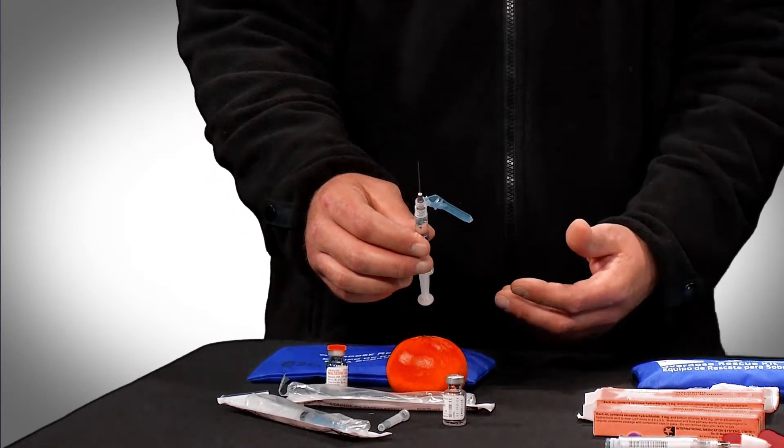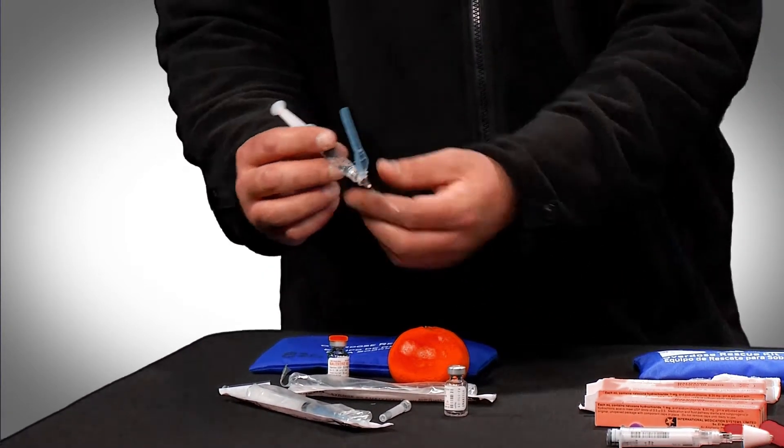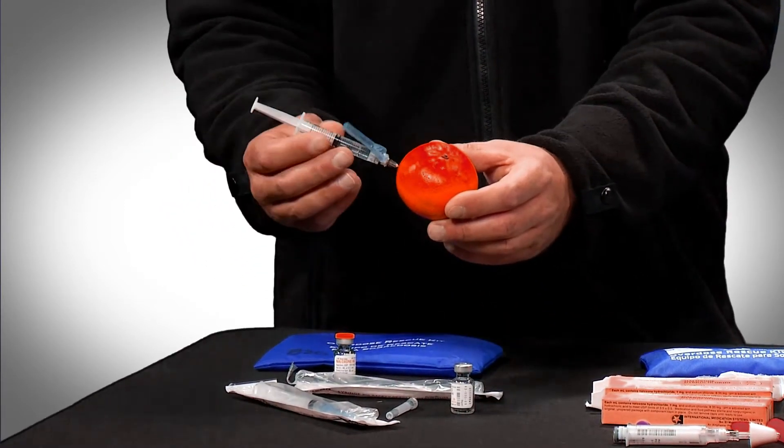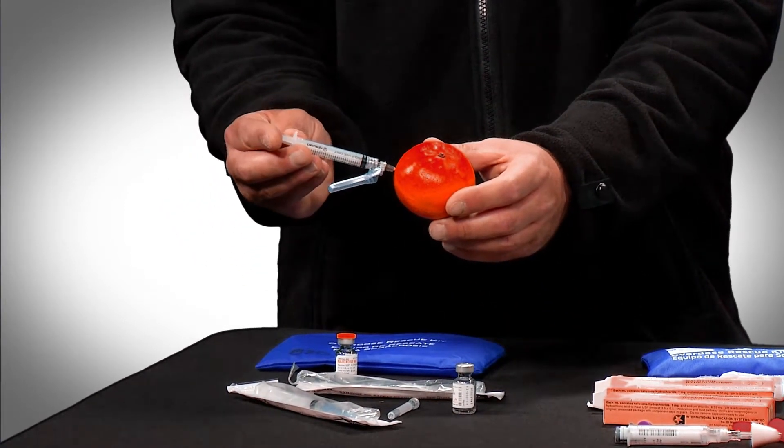You can go right through a person's clothing, and you don't have to worry about that air. So you just do a quick jabbing motion and insert the entire contents of the syringe into the person.